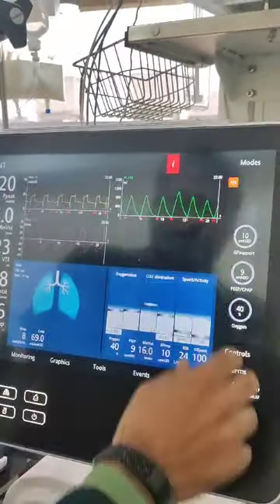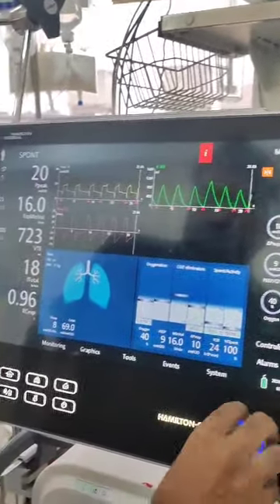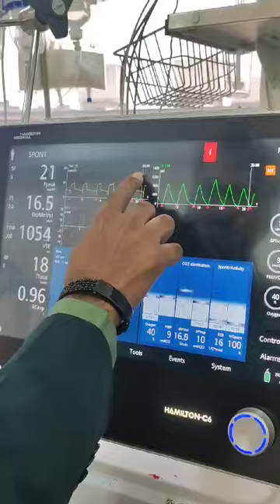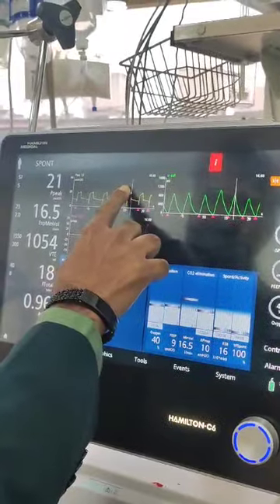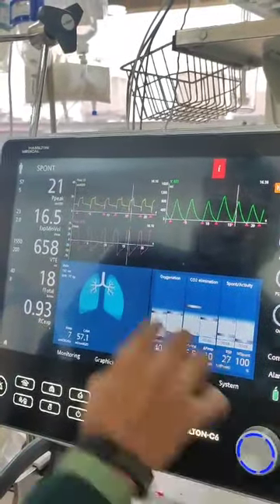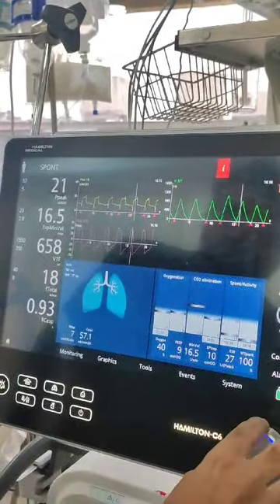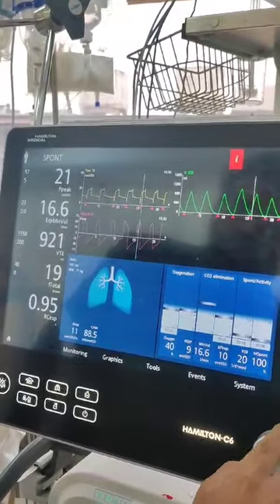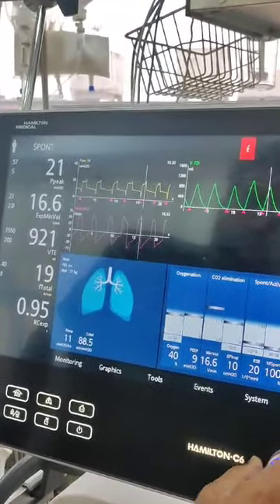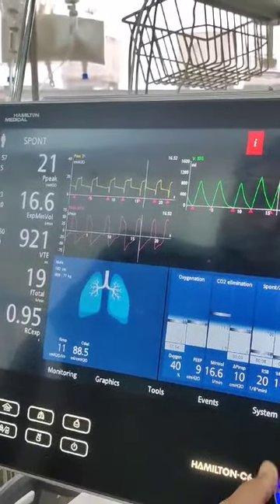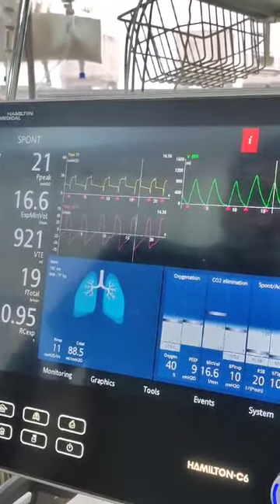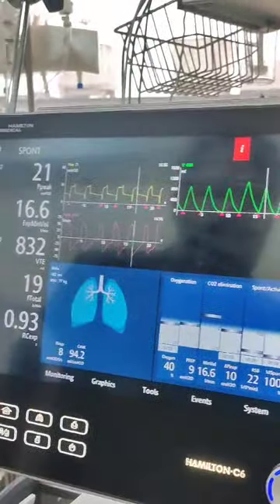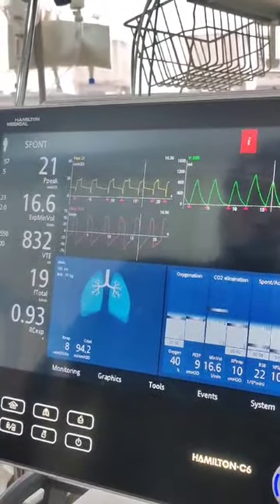I'll just freeze that and show you. As I turn the graph, you can see the pressures are at 18. And as we go up, you suddenly see a big blip in the pressure going to 21. So from 18 to 21 there is a significant blip in the pressure.